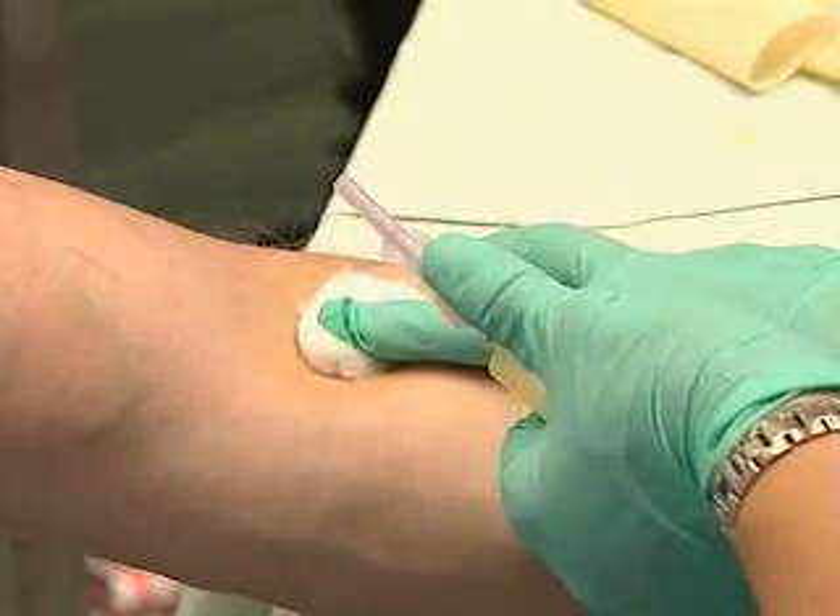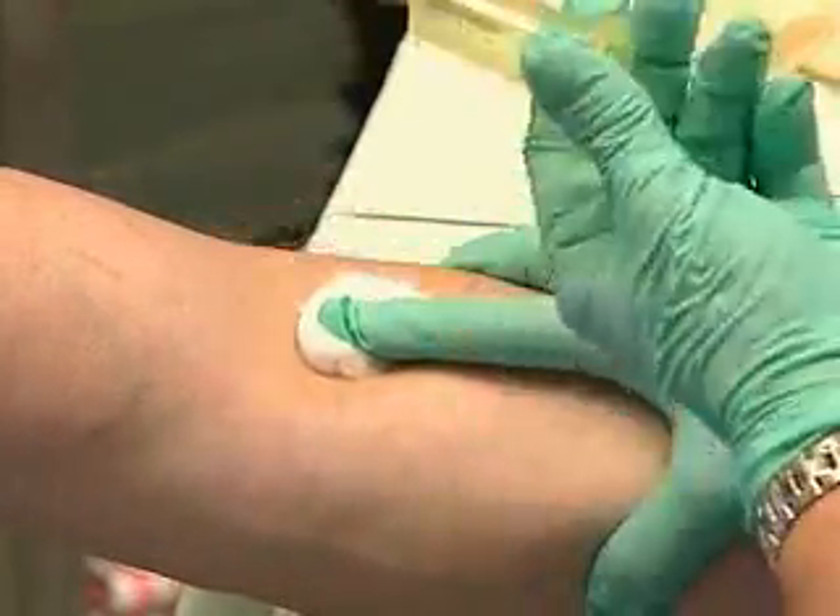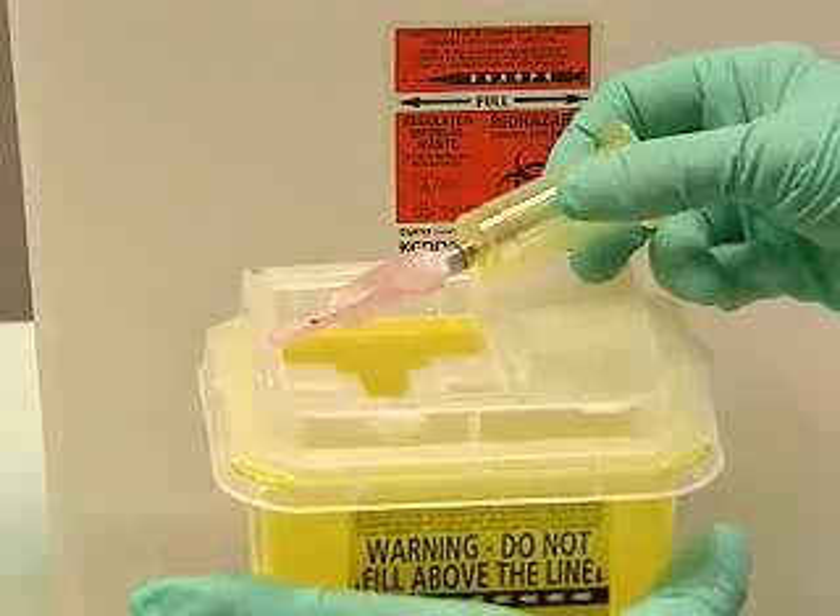Flip the needle guard back into place, protect the puncture, and the sharp goes right into the container.